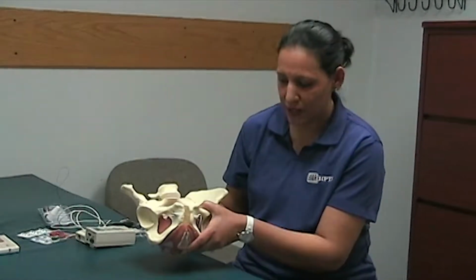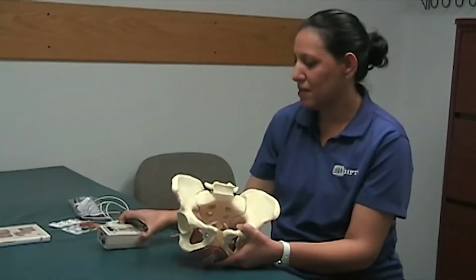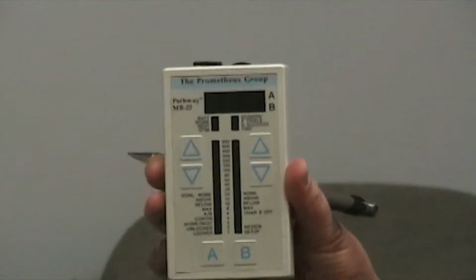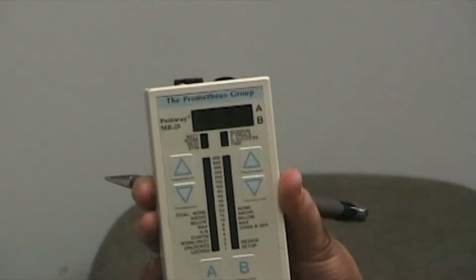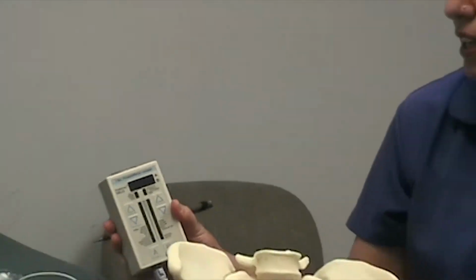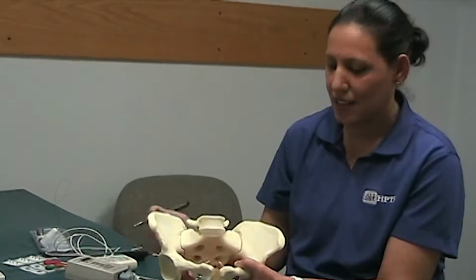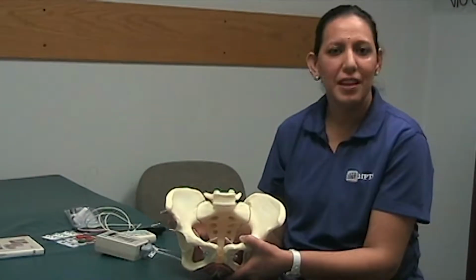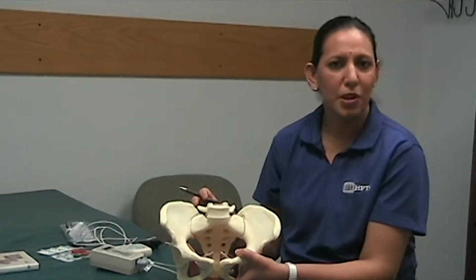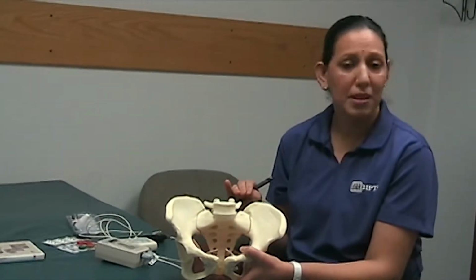So in order to train the pelvic floor muscles, we use biofeedback, and this is the unit that we use at our clinic. It's an MR25 unit. And we connect this to a laptop, and there's a software program that we can look at and see how the pelvic floor muscles are contracting. We train the patients to do their Kegel exercises on this unit, and when they look at the laptop screen, they're able to see how their muscles are contracting.